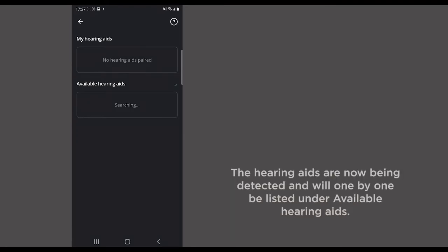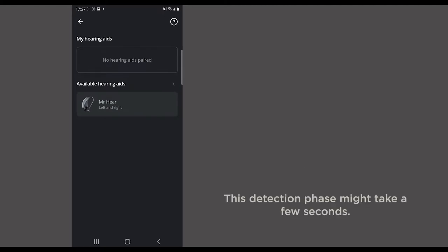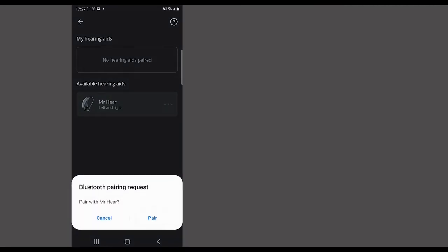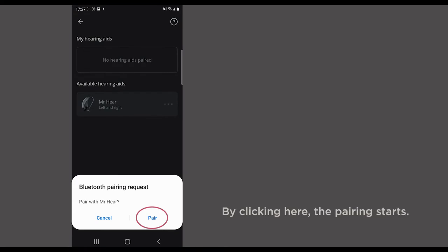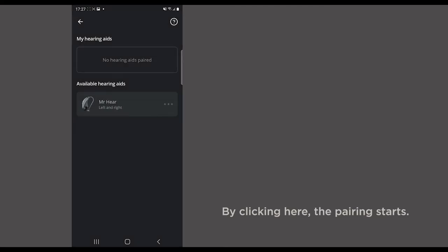The hearing aids are now being detected and will one by one be listed under Available hearing aids. Select Next. This detection phase might take a few seconds. By clicking here, the pairing starts.